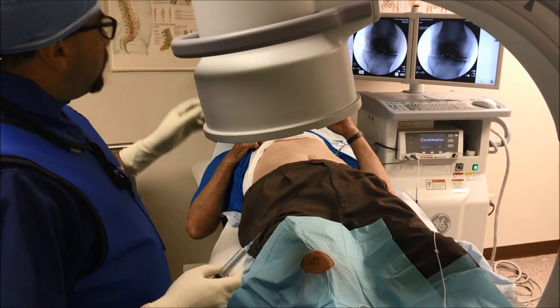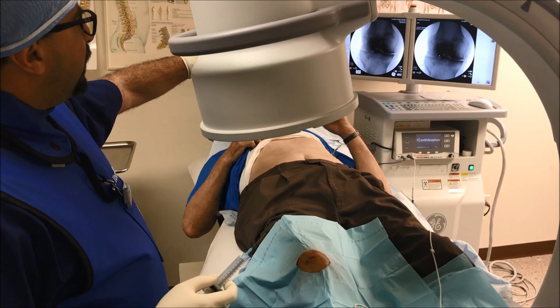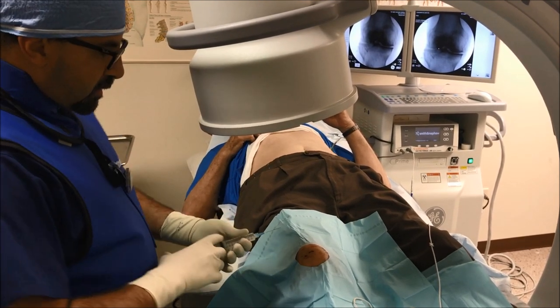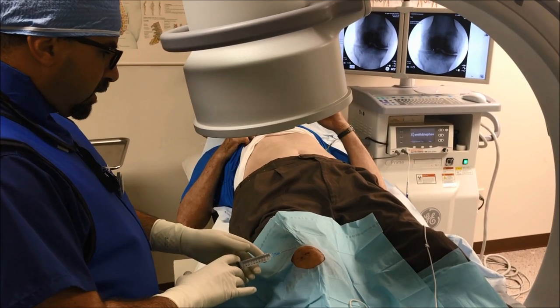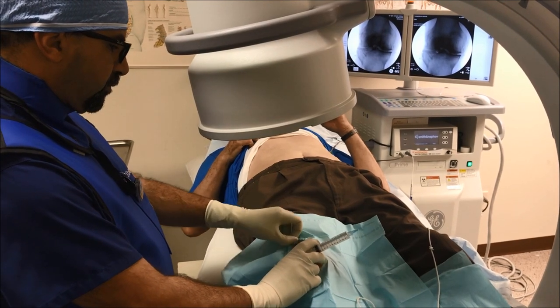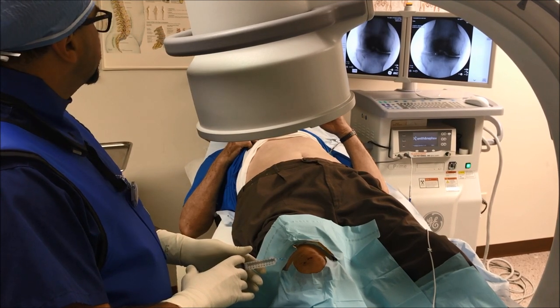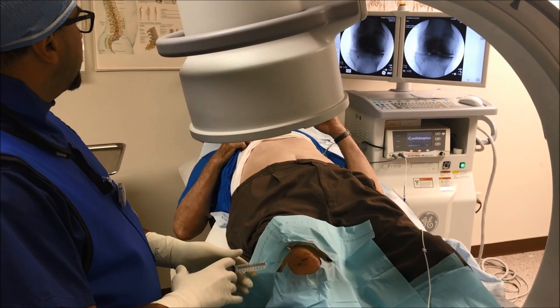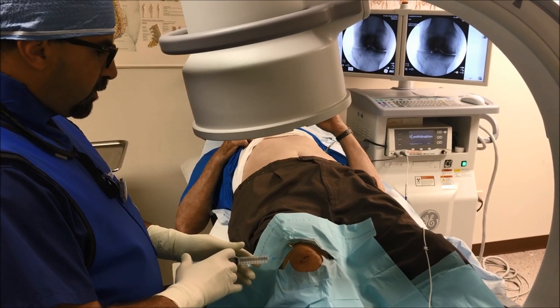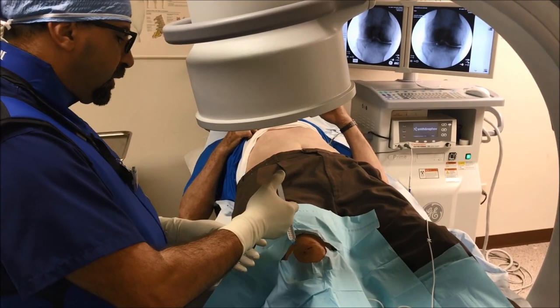As we look at the screen, this is bone-on-bone — that's how the arthritic knee looks. We will start by localizing the nerve. Initially, we put in local anesthesia; the patient is awake and we don't have to do this under sedation.